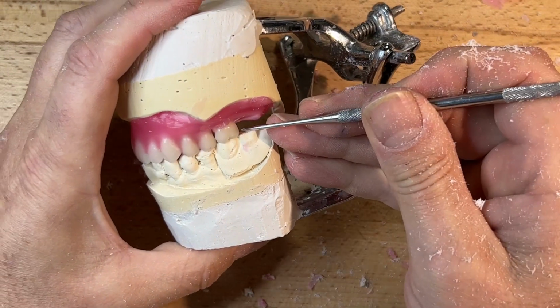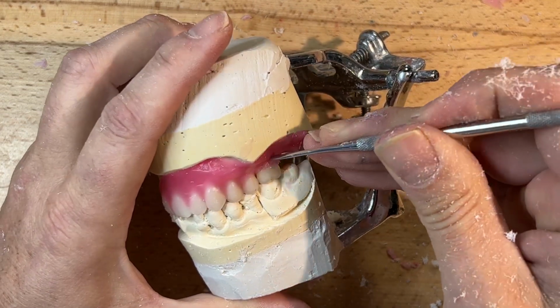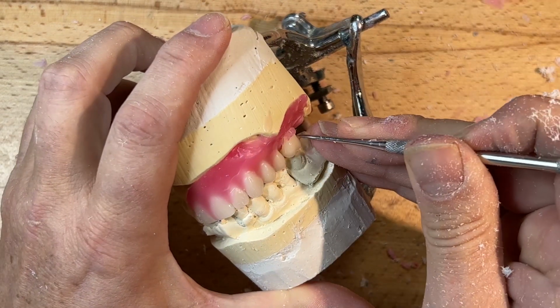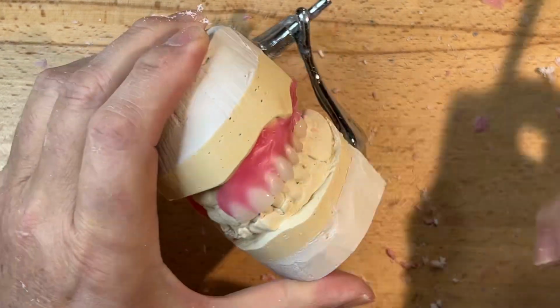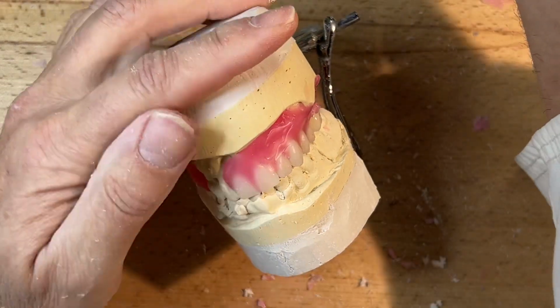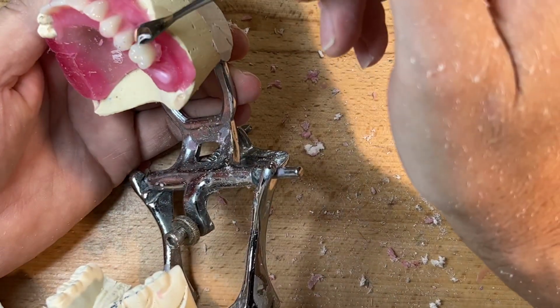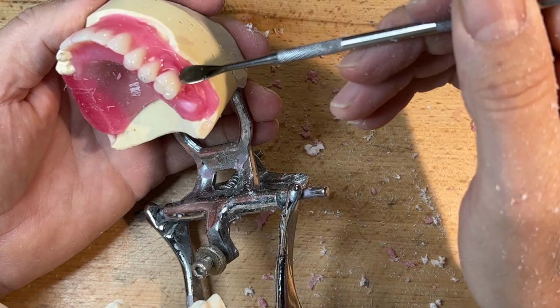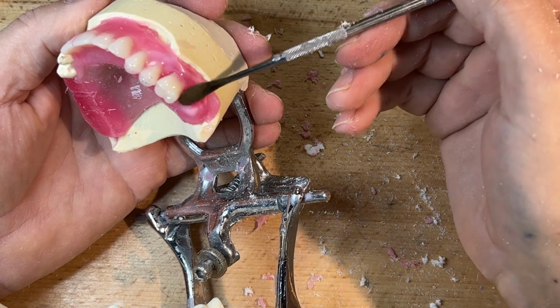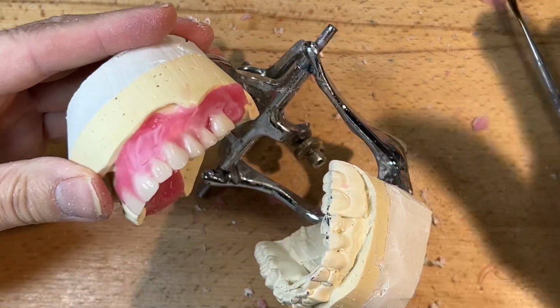You can see there's not as much overbite when you have this occlusion together. So I may customize the occlusion to give me more overbite, or just pop out the overjet to close out the buccal corridor. So we don't have the kind of black hole picture there. And let me see what that looks like. Maybe a little bit too excessive here on the buccal corridor. And we don't want to go outside the neutral zone and increase any kind of cheek biting.